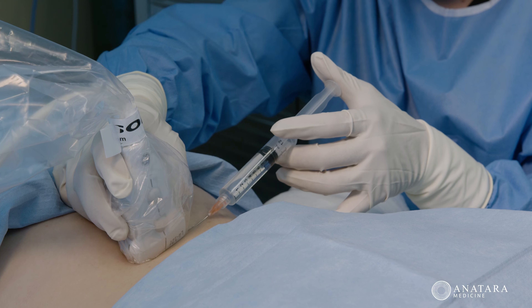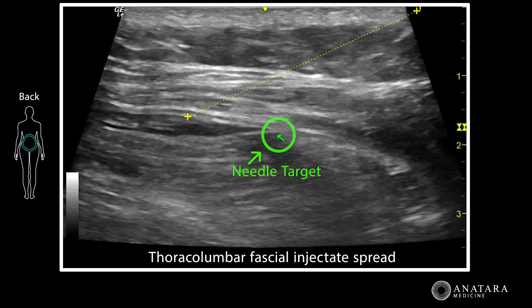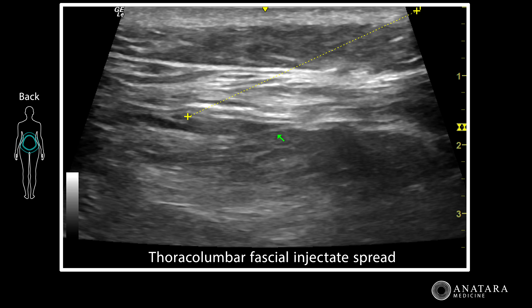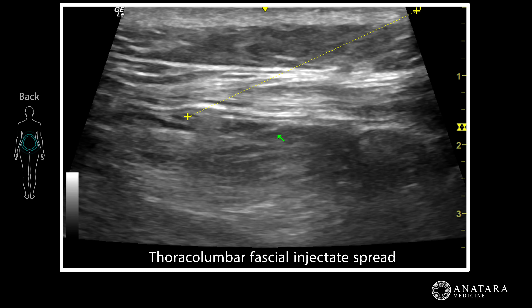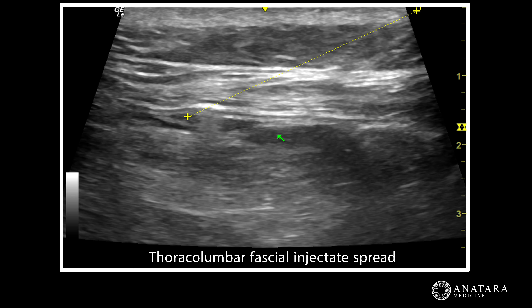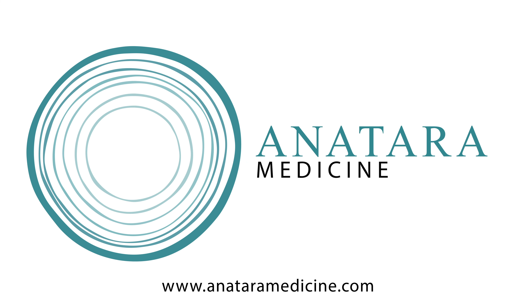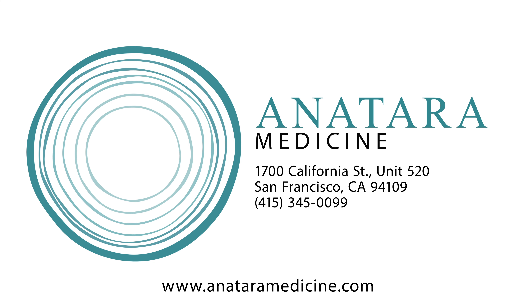A hydro dissection of the thoracolumbar fascia is one of the simplest and most effective ways to reduce lower back pain almost instantly and increase range of motion. Often patients feel a sense of opening and release after this injection, and it's very well tolerated.